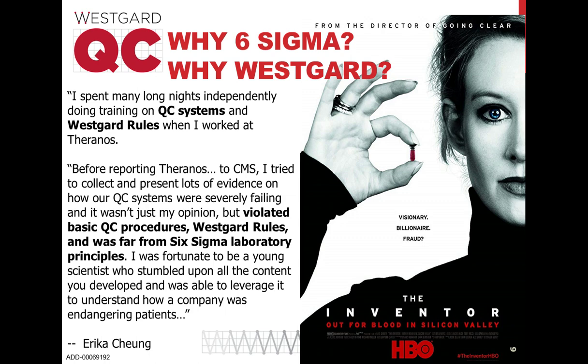We cannot just assume that because a manufacturer has a good marketing campaign and they assert that they have great quality, that therefore we don't have to do our jobs and we have no professional responsibility. What you see in front of you, of course, is a picture of the now infamous Theranos and its founder, Elizabeth Holmes, a company that took in almost $1 billion of funding and promptly destroyed all of it because at heart it was an instrument that had no quality. They could not produce reliable results.